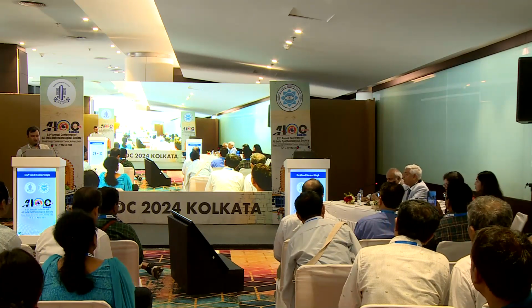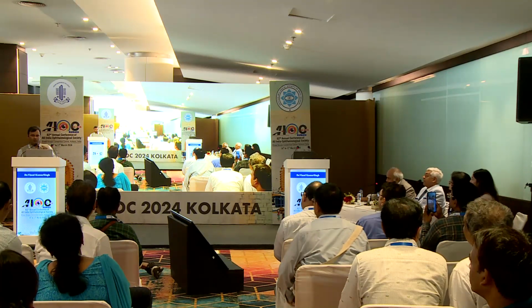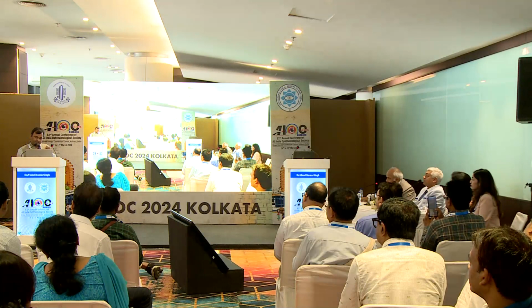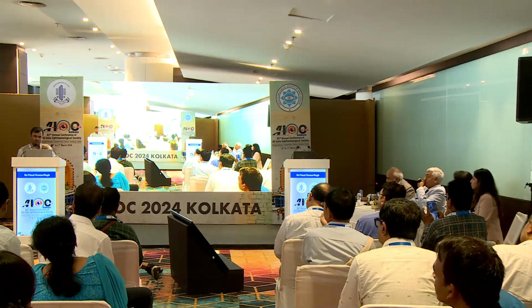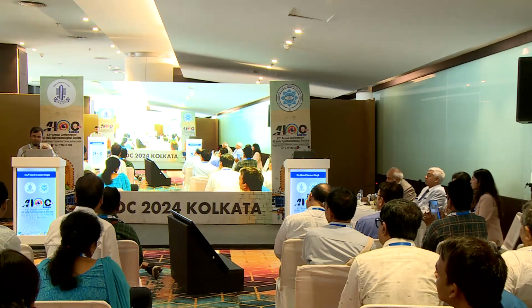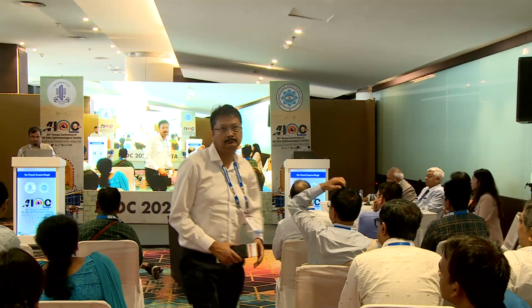Thank you so much. One more point I would just like to add. While enclavating the second side of the IOL, while you are holding your IOL with the forceps, you should pull a little bit of the lens anteriorly towards your port. Because while you are holding the lens, your superior iris dips downward, so you are not sure whether it is covering the whole pupil or not. So you can put a little pull towards yourself, then enclavate it. Then the whole pupil will be covered with the IOL.